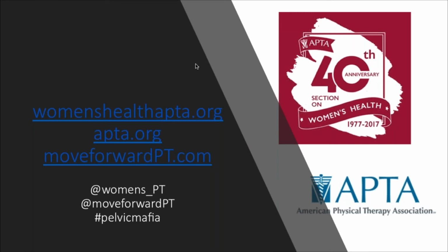So using ultrasound, especially within those first 6 weeks after delivery, patients are hesitant quite often to do a vaginal exam until they have their follow-up with their physician, which is fine. Ultrasound will give us some idea as to what's going on with the pelvic floor function, because you're still using the pelvic floor during that time, and it's a nice opportunity to start to train some gentle contraction and relaxation. So the short answer is really any age can be quite helpful.